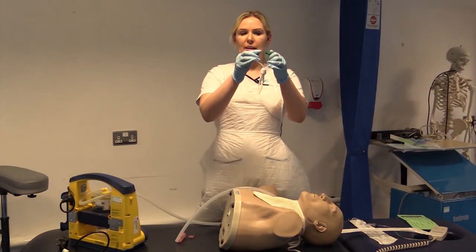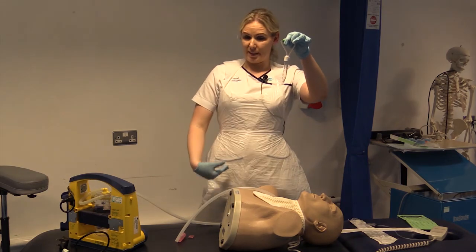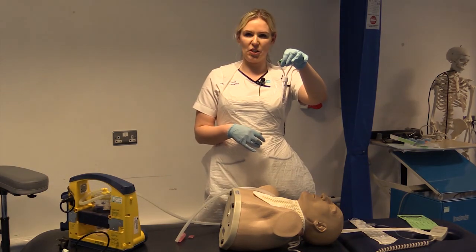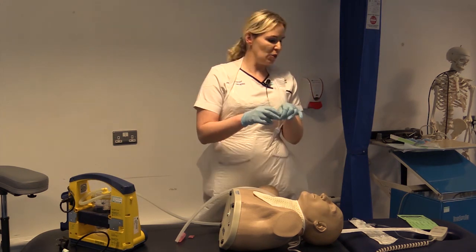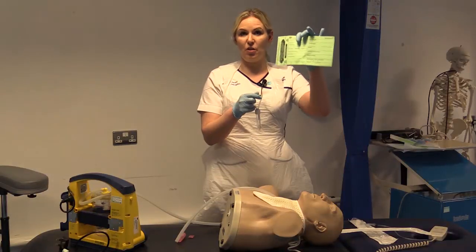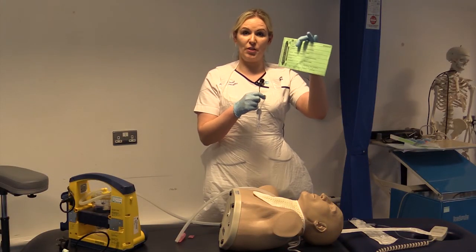Okay, and you're going to close that over in the patient's room. Still wearing your PPE, you're going to pop that into a bag, and for our COVID-19 patients, we're going to need to double bag that. It's really important when you have finished your suction that you have all the necessary information on the front of your form, or that will not be accepted. Okay, and you need to get that off as soon as possible.